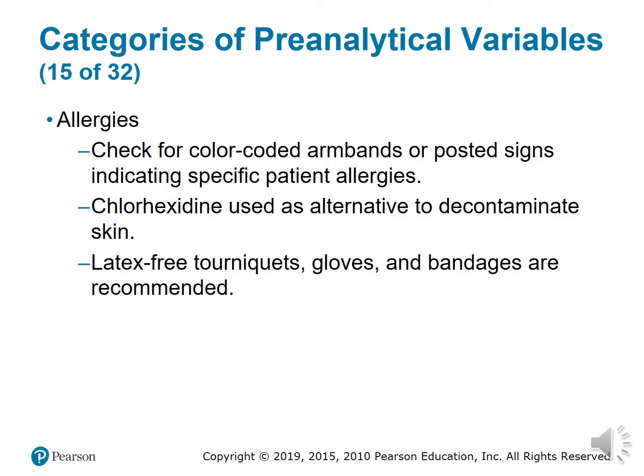Chlorhexidine is used as an alternative to disinfect a venipuncture site when a patient is allergic to the other disinfecting agents that are commonly used for venipunctures. And yes, some people are allergic to alcohol.